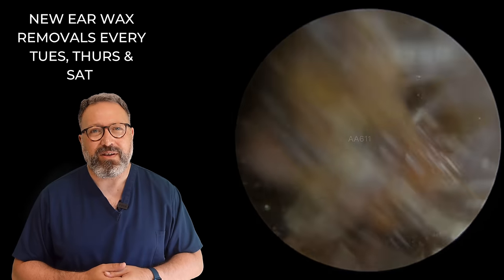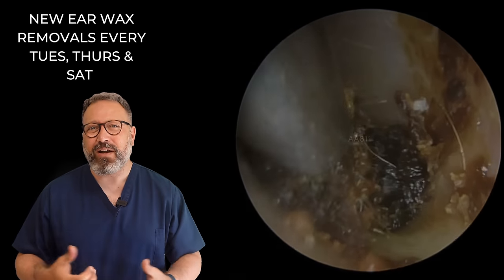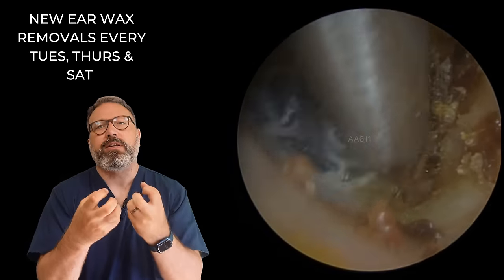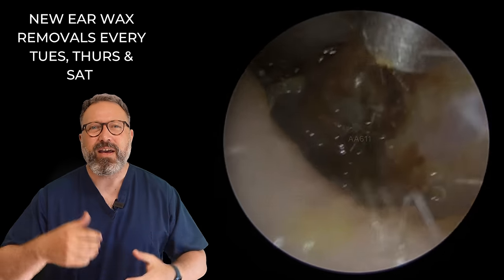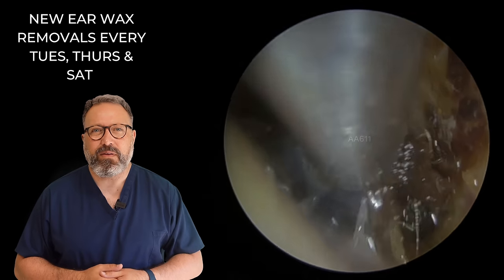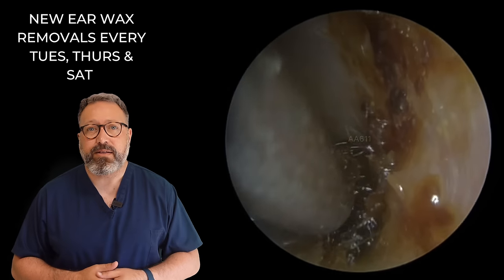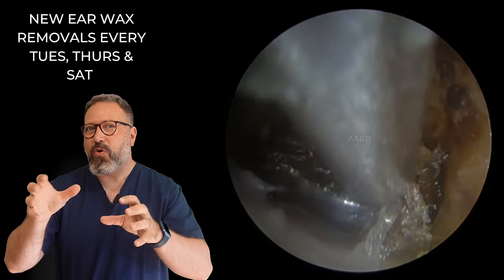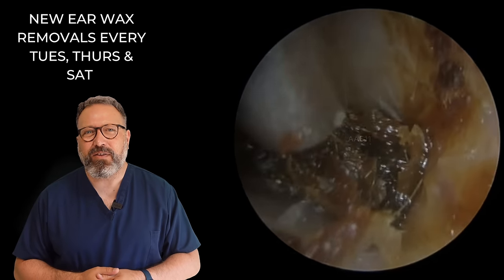Let's give this a little bit of a wiggle. You can see it's a very odd consistency — these really dry chunks mixed in with this really sticky, clay-type wax as well. Not a great mix as far as wax removal is concerned. As we lift, you can see all that dry skin peeling — that's what's been anchoring this plug into place, holding on to it really, really tightly. You can see that dry skin all starting to peel away. I've added more olive oil now because it's so sticky and so dry. Just lifting from the sides, teasing into the center of the canal. We've got the left-hand side really mobile, but the right-hand side is still pretty stuck. You can see that layer of dry skin coming away underneath — this is what's been anchoring everything in this ear canal into place.